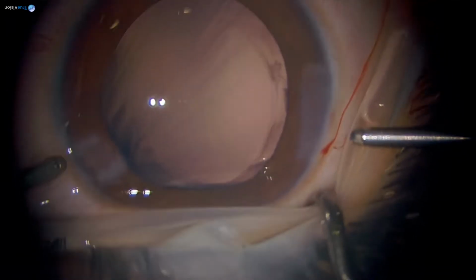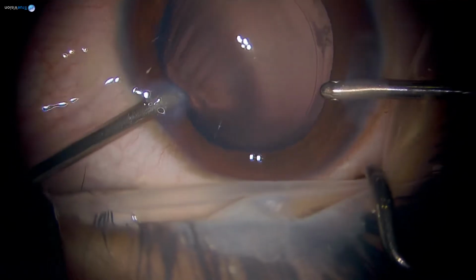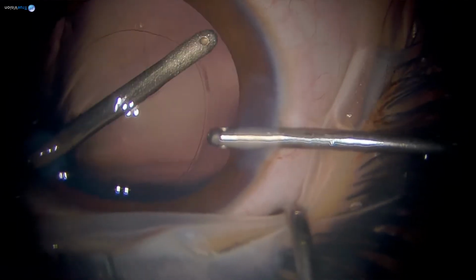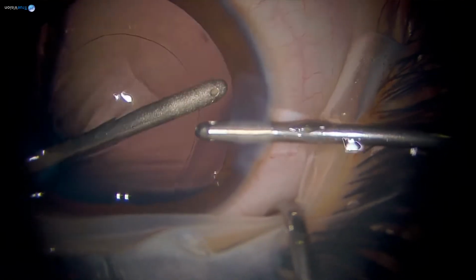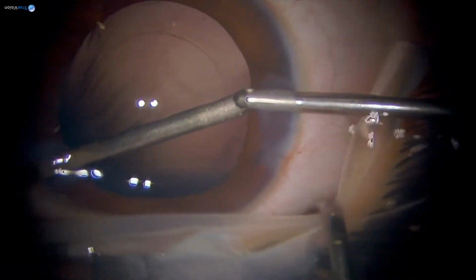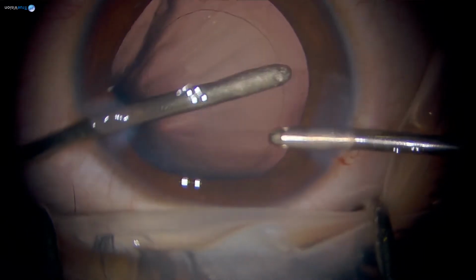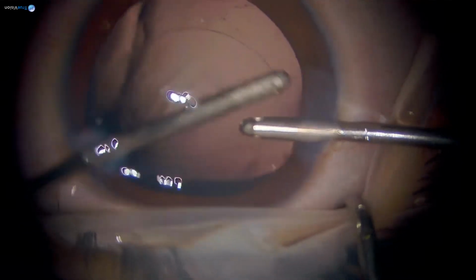Do you think this helps with both PCO and late decentration? Do you think removing the epithelial cells helps with decentration or no? It helps to prevent the posterior capsular opacification. These lens epithelial cells are like stem cells. They can proliferate over a period of time and they can come behind your capsule, and we have to clear it as much as possible within the limitation.